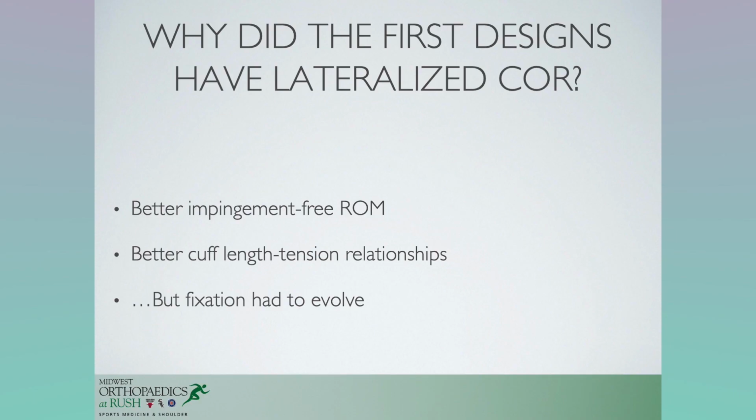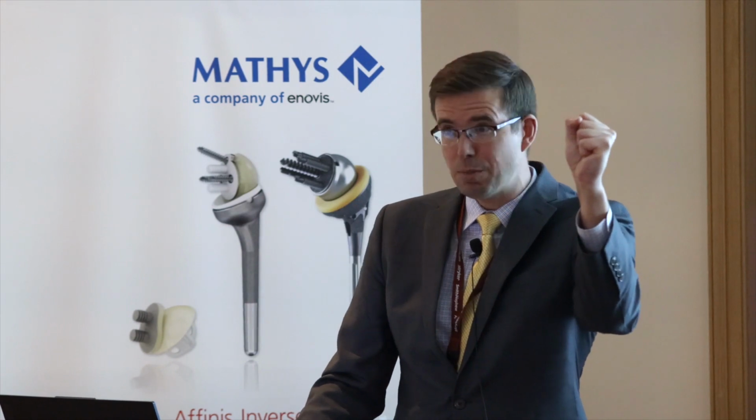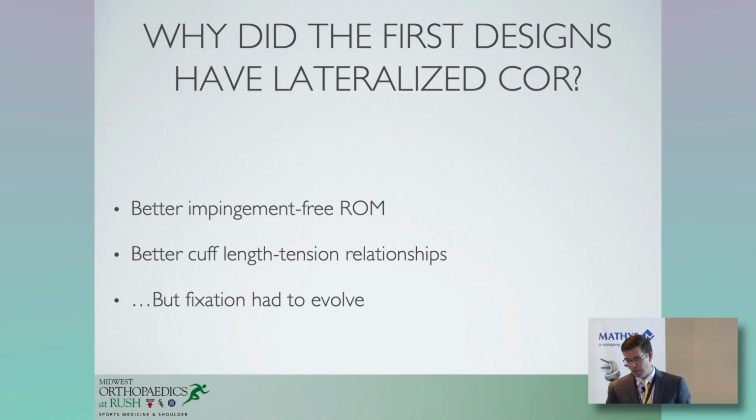So why did these early designs all have that lateralized center of rotation? Better impingement-free range of motion, better cuff length-tension relationships, right? So that Blix curve we all remember from med school, right? If you're trying to grip something and you bend your wrist as far as you can and then try to grip, you can't do it. Try it right now, it's impossible. You need that length-tension, but the fixation had to evolve over time.